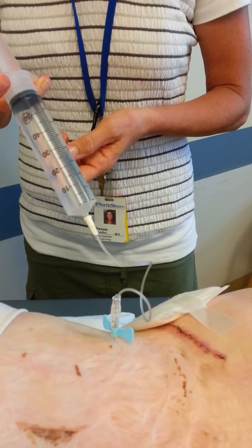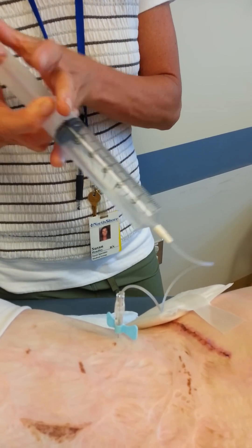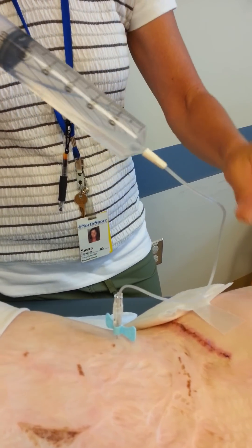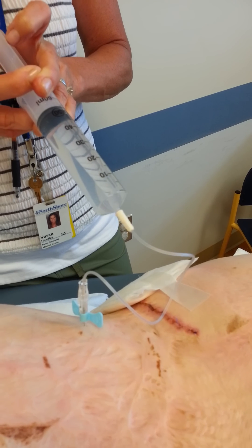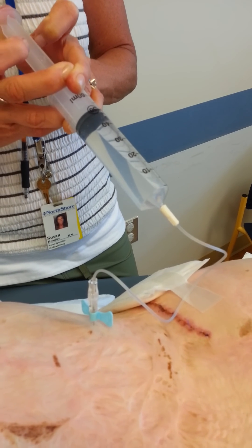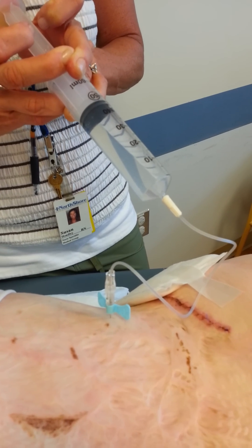So I am going to now just start to fill. Don't expect that you can do this really quickly because you're pushing saline through a big syringe into a skinny, tiny tube — so it just doesn't go fast. Would I worry right now about how the expander feels? Heck no. It's a big one. We're getting at least 60 in there today, and then we'll start to feel it after we've put 60 in.